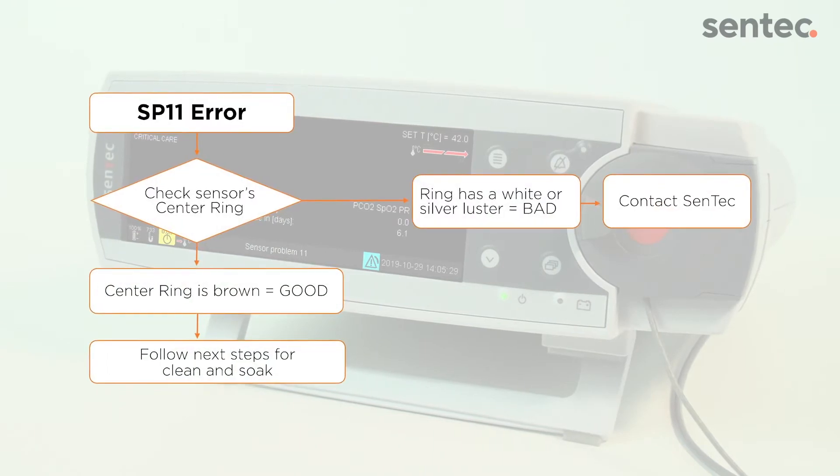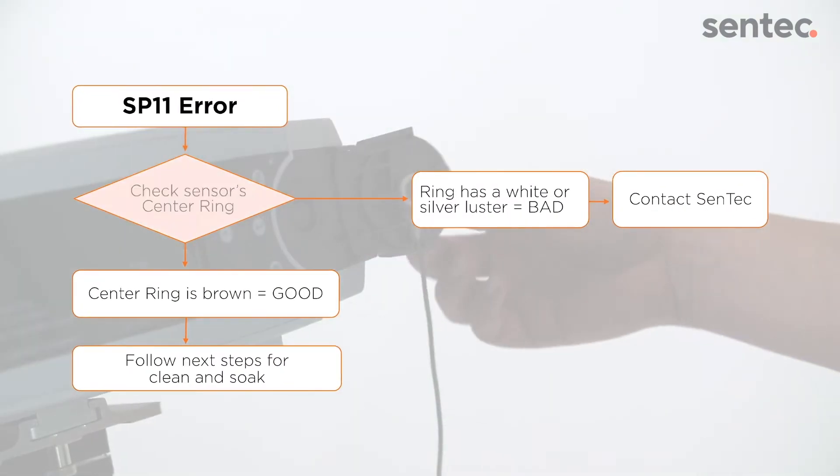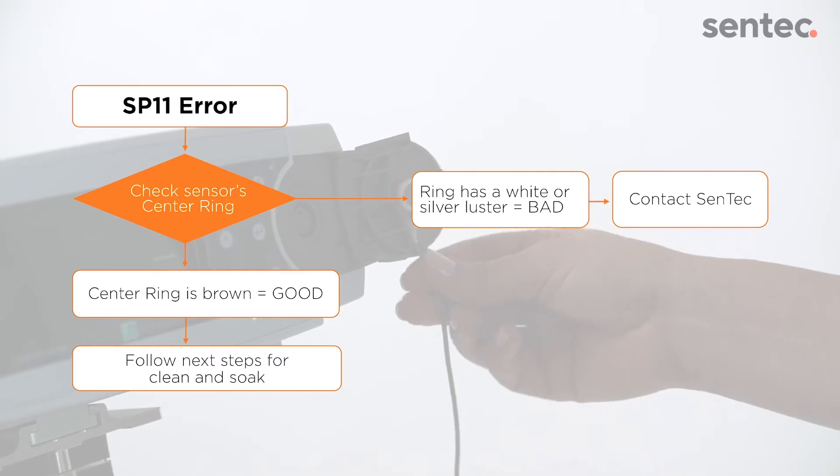Use this flowchart to troubleshoot the SP11 error. First, check the center ring on the sensor.